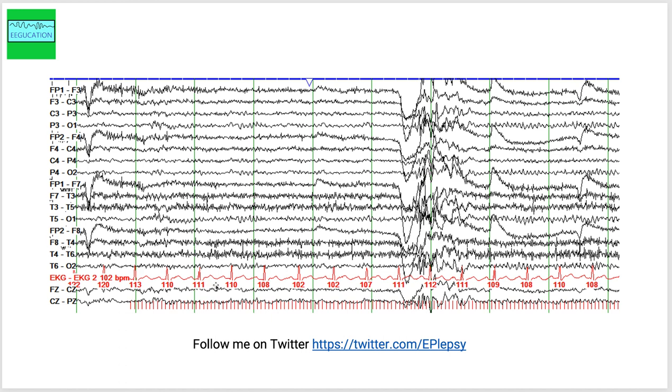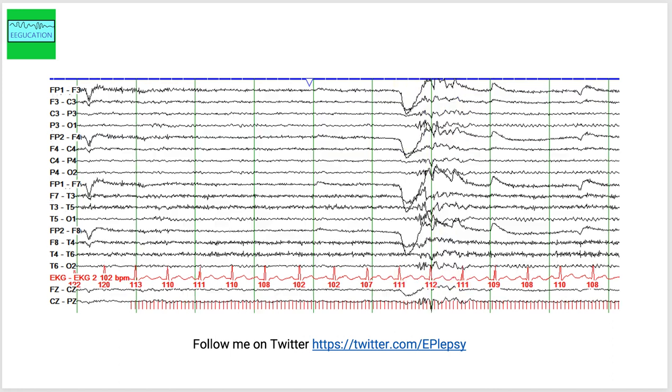Now what you see here is the flash rate has been increased here and this discharge, you see some fast frequencies in a generalized distribution with some spikes. We'll change the gain of this. And you can see there is some change in here.